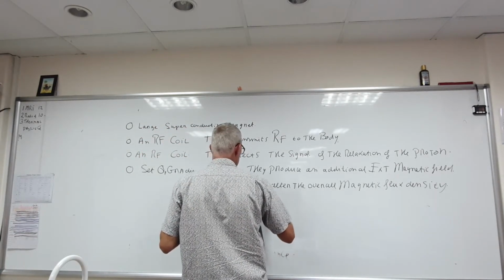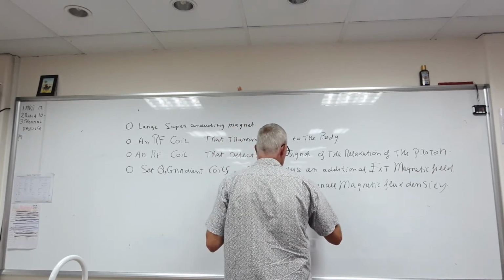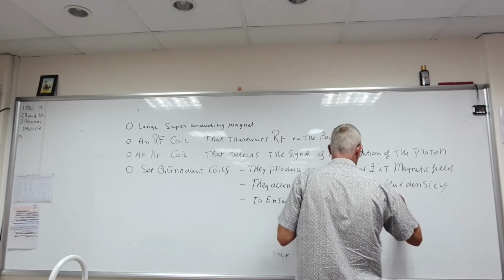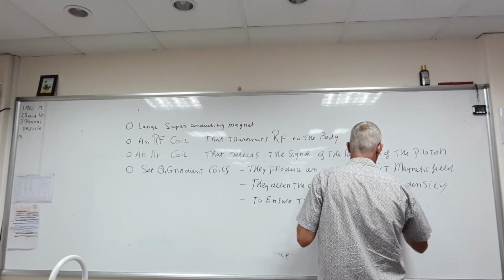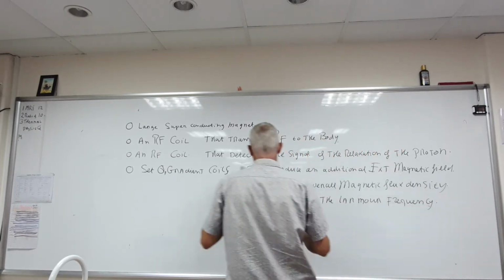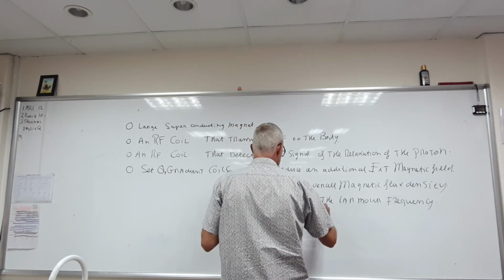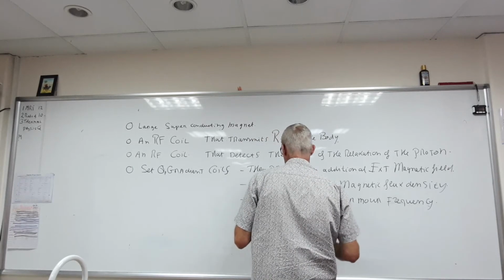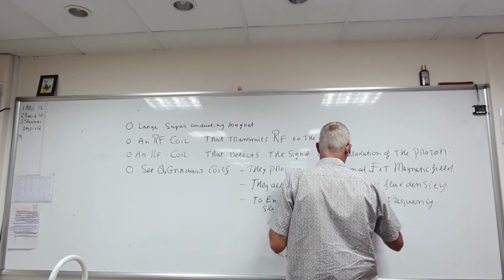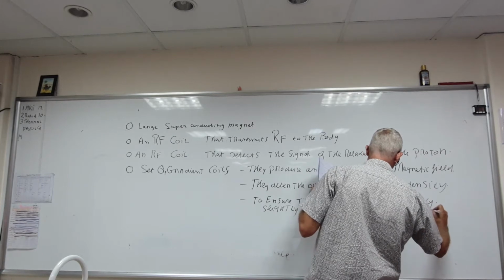So to ensure that the Larmor frequency slightly differs for each part of the body.